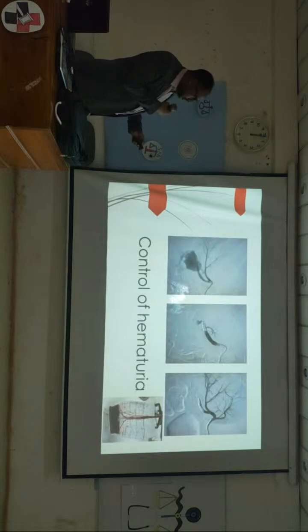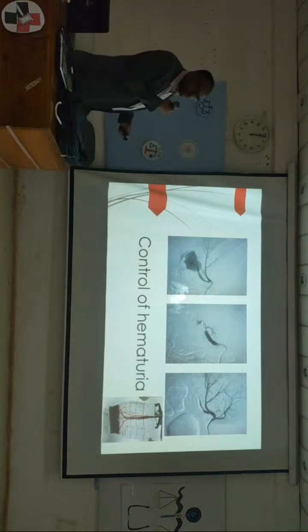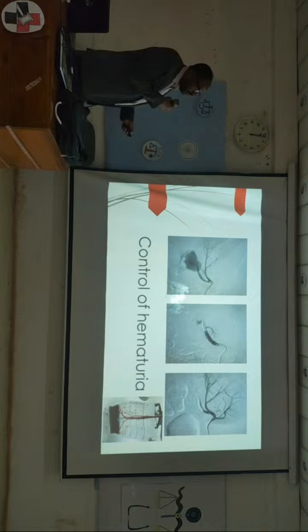Another patient, postcoital bleeding, the same thing. Another patient with massive hematuria following iatrogenic injury of the renal artery. Here, this is the pseudoaneurysm, this is the lesion. In the past, the treatment of such a condition was nephrectomy, to go and resect the kidney. But after interventional radiology procedures became available, we go selectively by catheter and microcatheter to the lesion here, just to occlude the problem and to treat the lesions. And here is the one branch, and we occlude it here, and the patient recovered well.